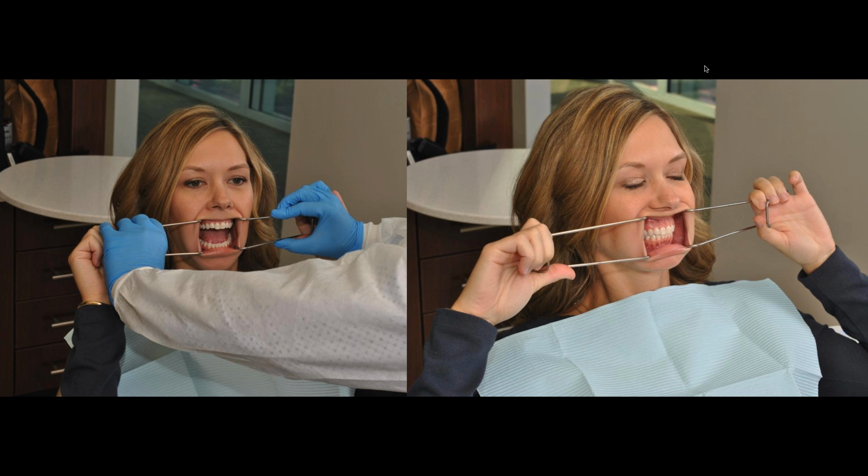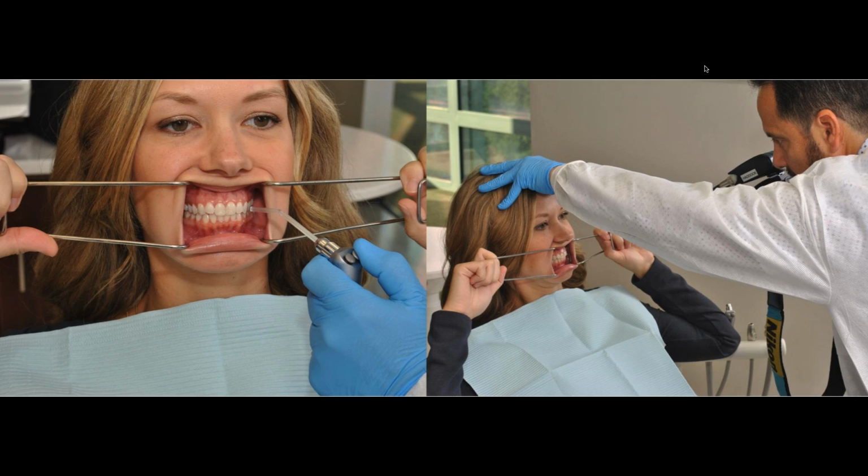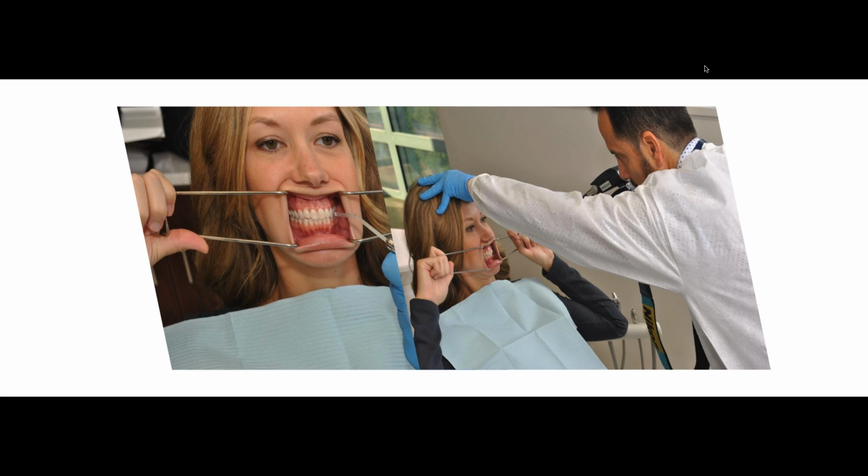I don't have my assistant, and obviously I cannot do it myself because I'm holding the mirror with one hand and the camera with the other. Now, I'm going to tilt the patient's head so that she faces me, because she's seated at this point in the dental chair. I have her face me to have the best position possible, and then I go ahead and dry the teeth. Every single dental photo, ideally, should be taken with the teeth dried.